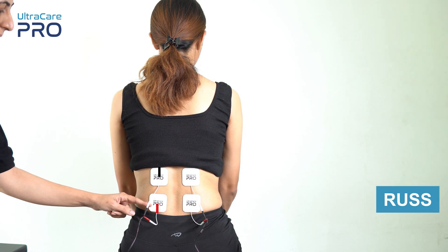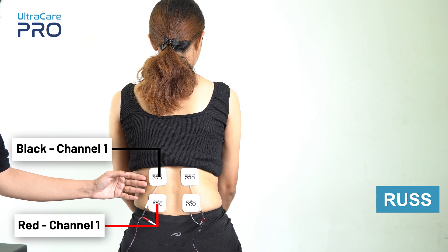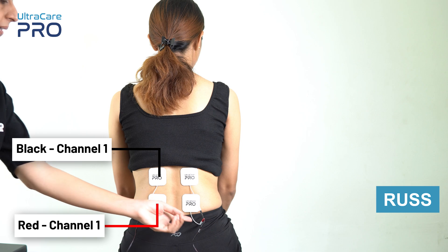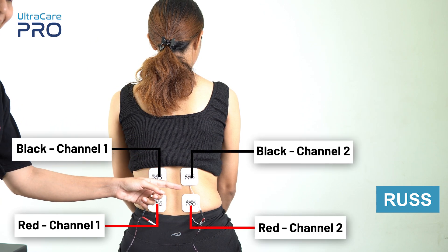For Russian currents, place the red and black electrode from channel 1 on one side of the low back region over the muscle that needs to be stimulated. Similarly, place the red and black electrode from channel 2 on the other side of the back over the muscle that needs to be stimulated.